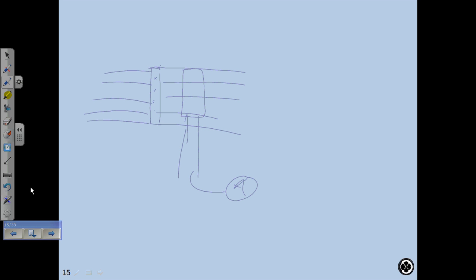And you're going to plot reading versus gap. You're sweeping this gap over the chamber. So this gap varies from, I don't know, it might start at 1 cm, then 0.5 cm, then 0.1 cm. And what you do is you plot the reading you get.